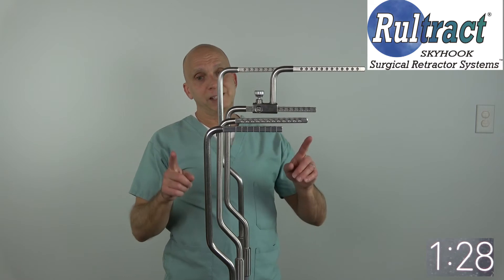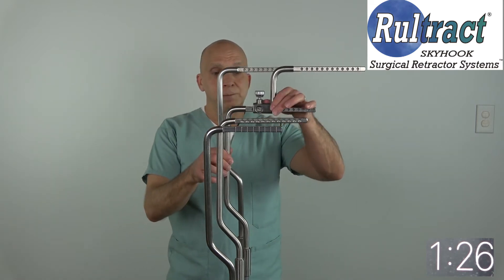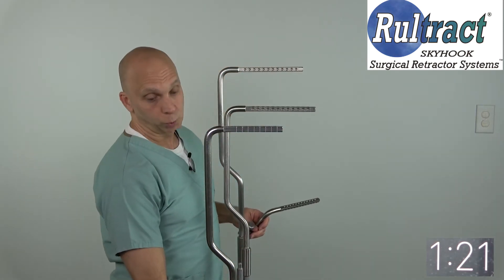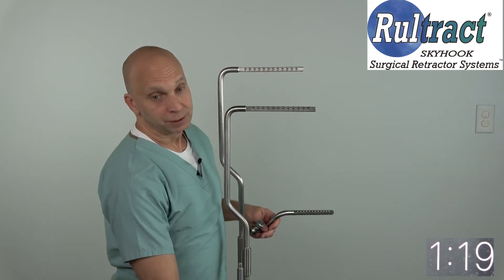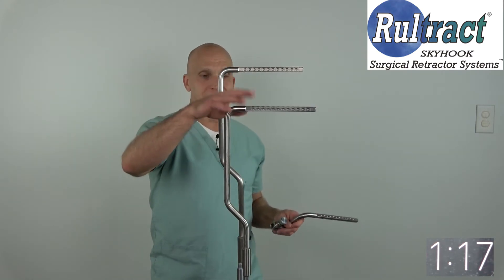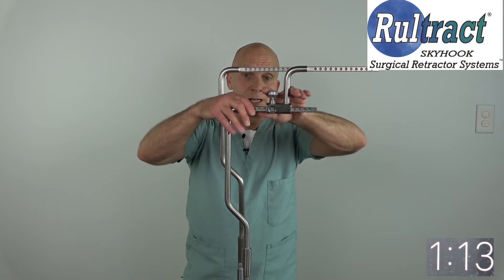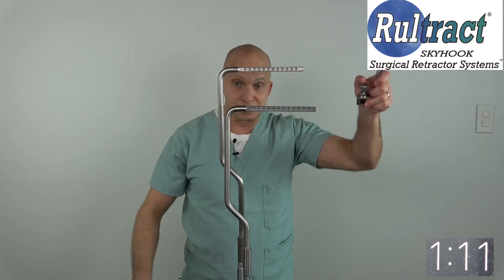The reason I like this better is if you take your new generation standard length top post — take the old ones out — and put your riser on, you have the additional height. But if you don't need the additional height, you go ahead and take this off.